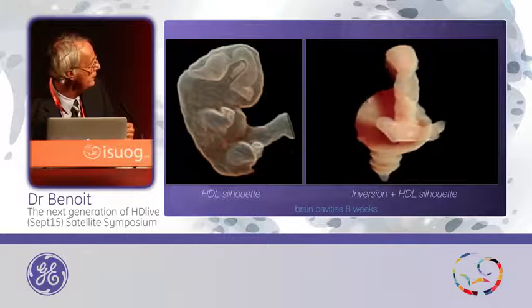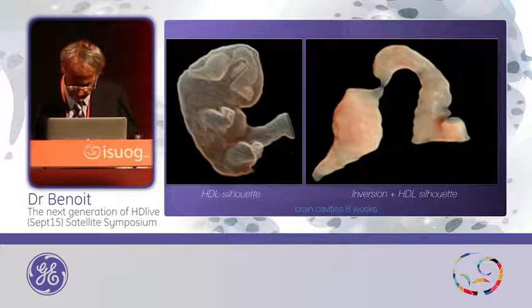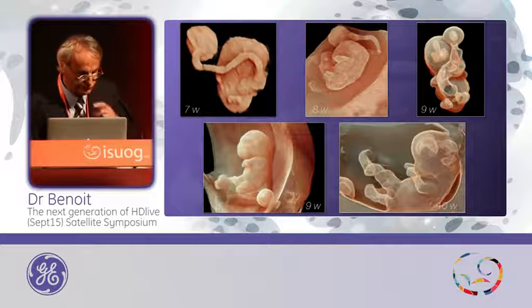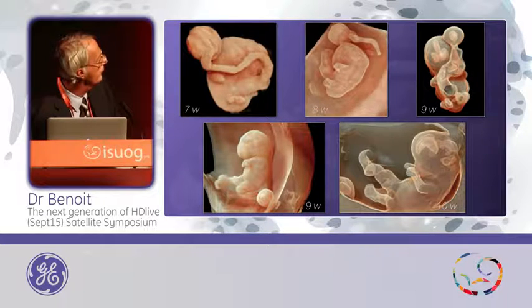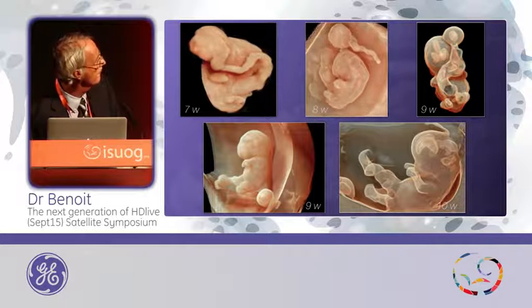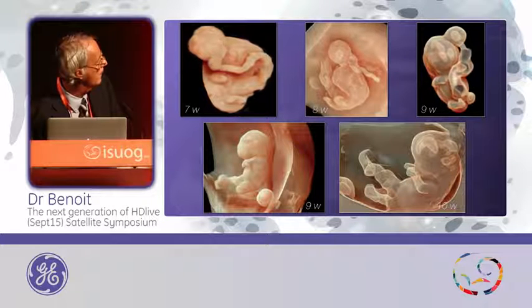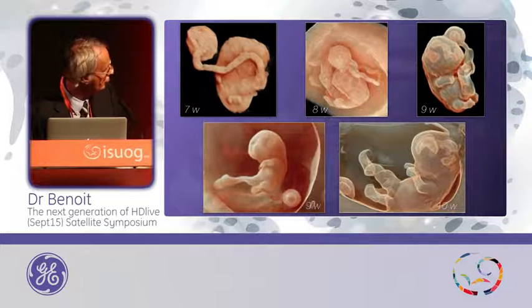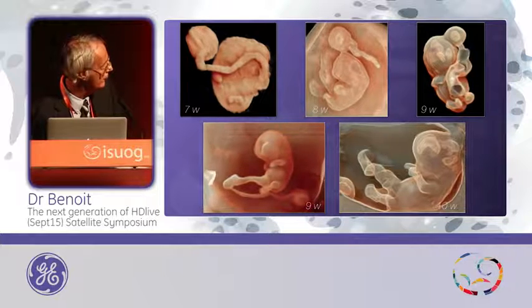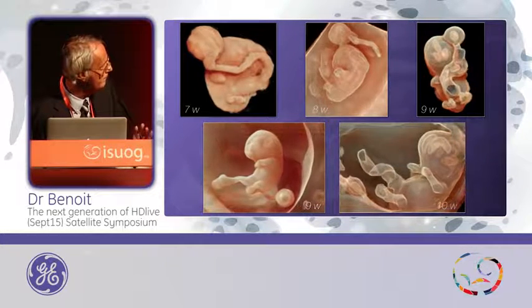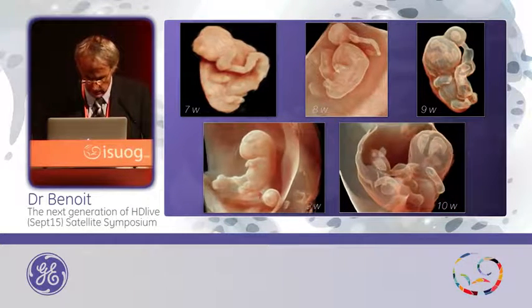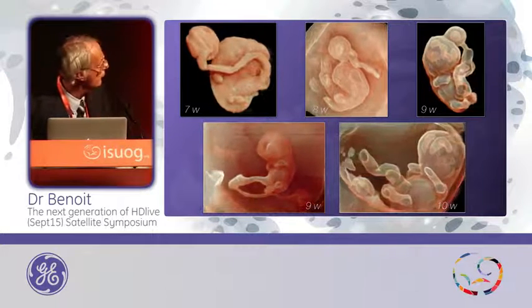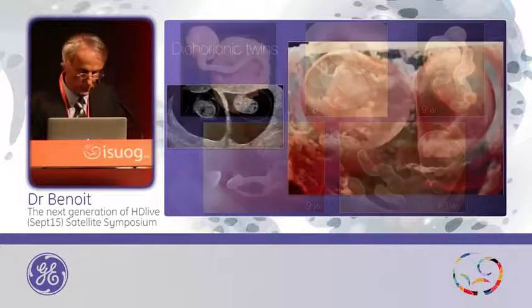This is a result with inversion and also with HDLive. Now some examples in the first trimester of pregnancy: the first one at seven weeks, then eight weeks, nine weeks. And this one at nine weeks of pregnancy — we can clearly see the vitelline duct connected to the umbilical cord. And this one at ten weeks of pregnancy, where we can really recognize the two lateral ventricles.